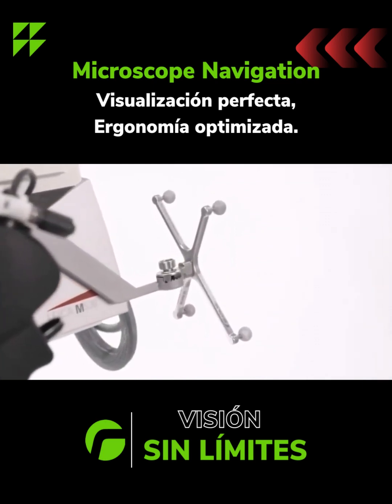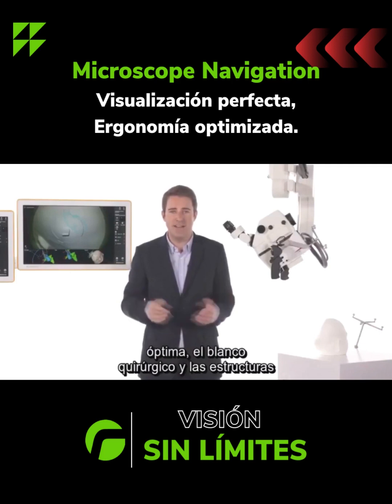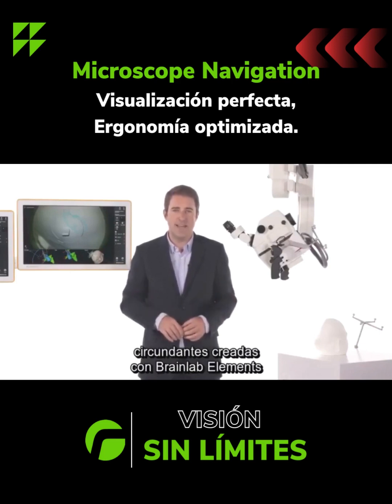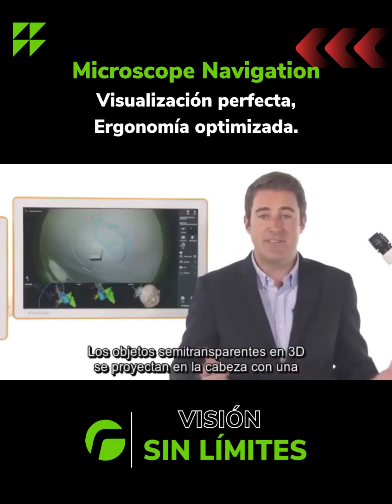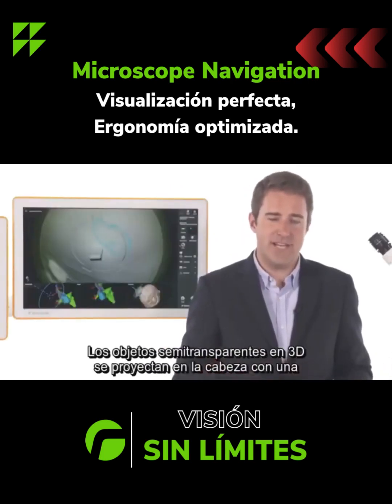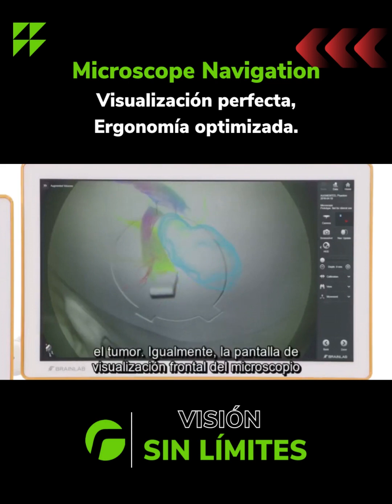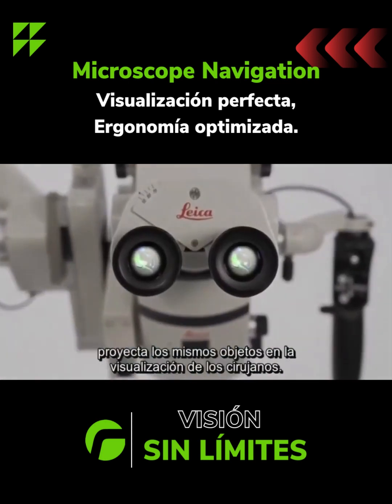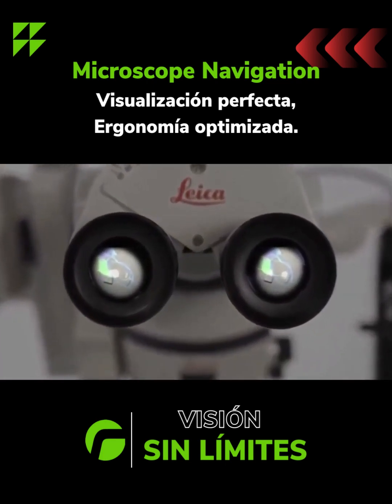patient's dataset. To support optimal craniotomy planning, the surgical target and surrounding structures created with BrainLab Element software are displayed on the navigation screen. Semi-transparent 3D objects are projected inside the head with detailed tractography, fading in and out when proceeding toward the tumor. Likewise, the microscope head-up display projects the same augmented objects into the surgeon's view.